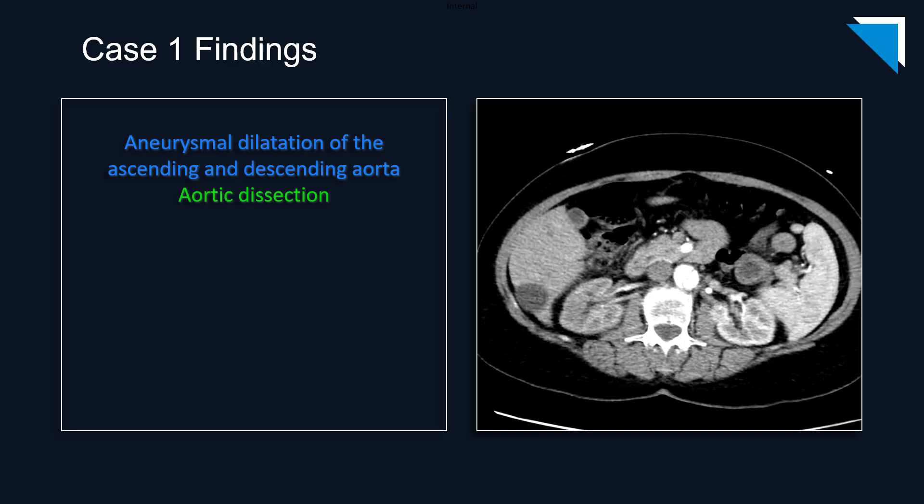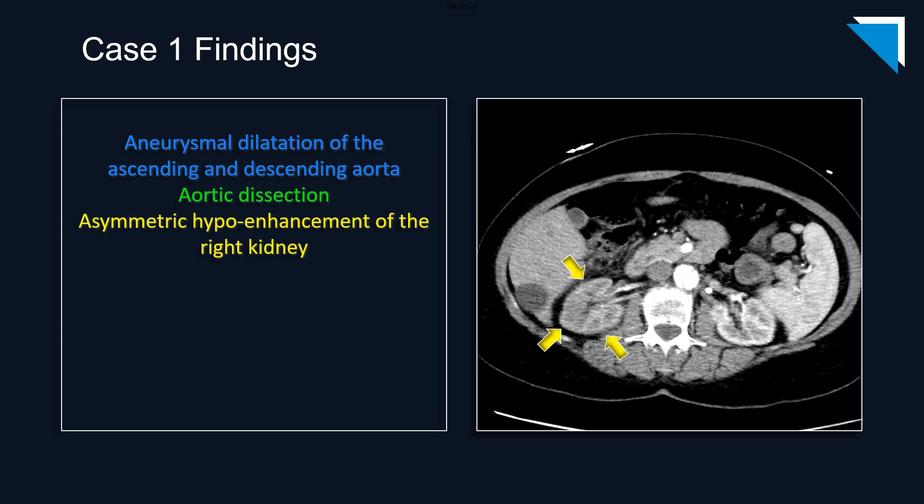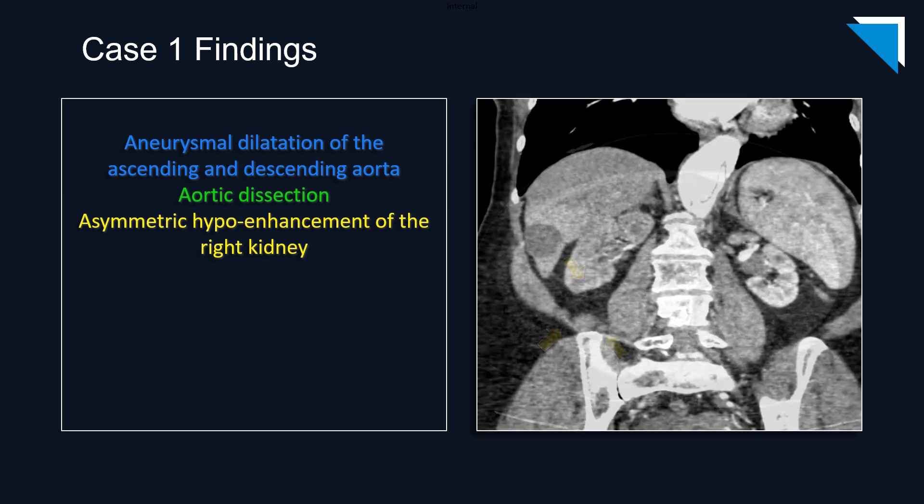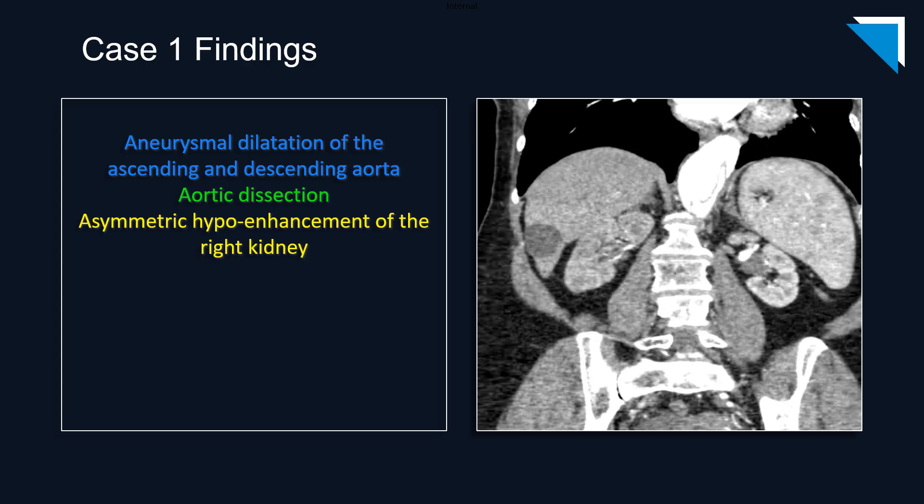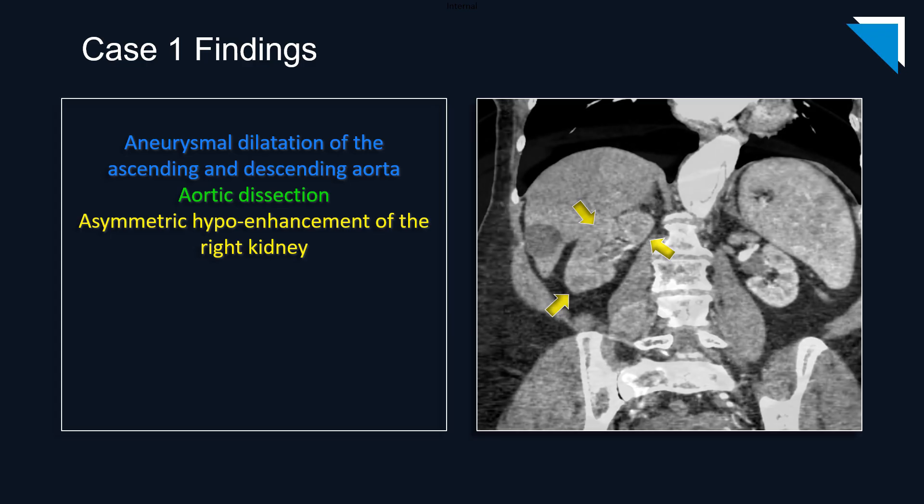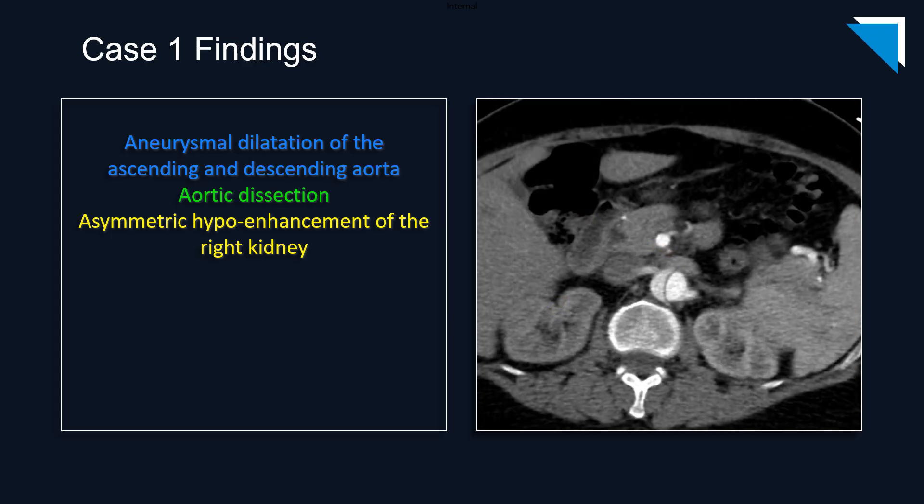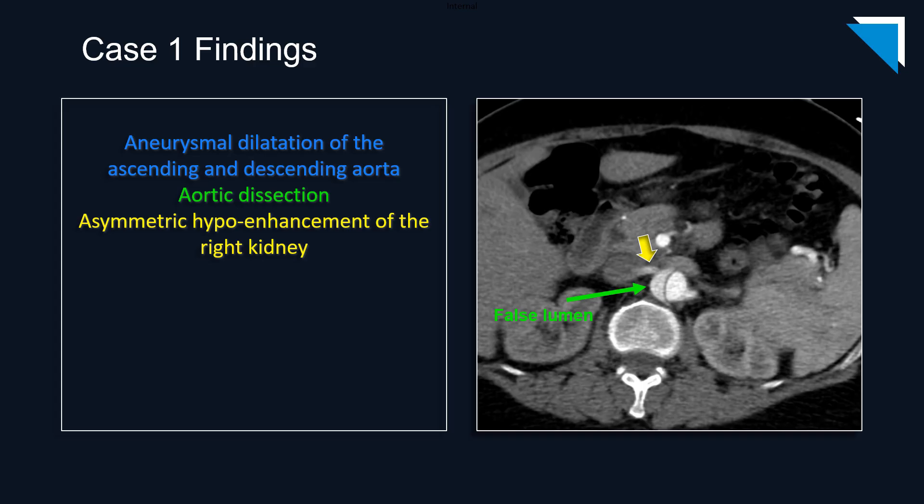Another axial slice at the level of the kidneys reveals asymmetric hypoattenuation or hypoenhancement of the right kidney relative to the left. On this coronal image, the differential enhancement of the kidneys should be clear. Following the right renal artery back to its origin, we can see that it originates from the false lumen of the aortic dissection, which accounts for the hypoperfusion of the right kidney.